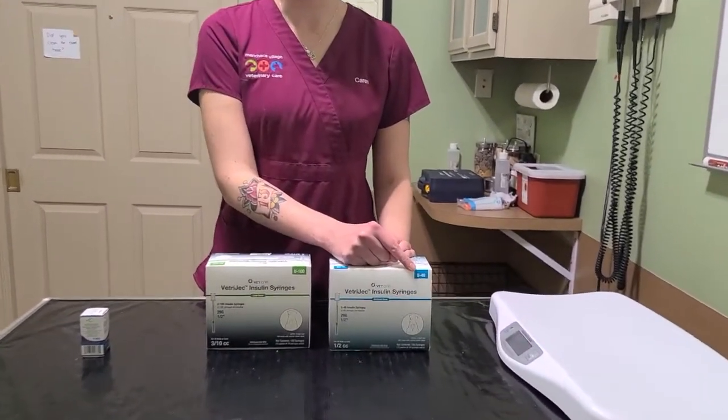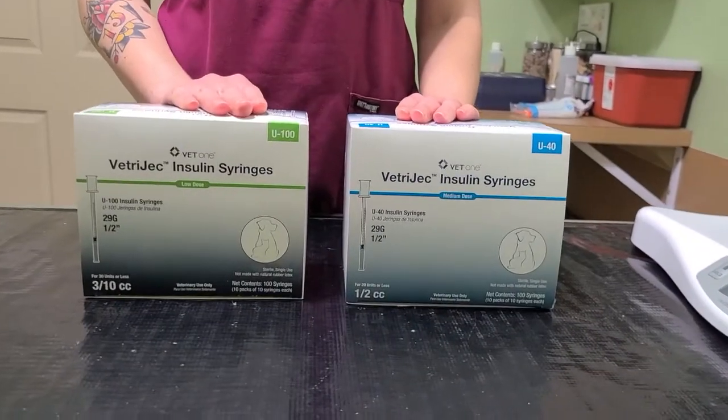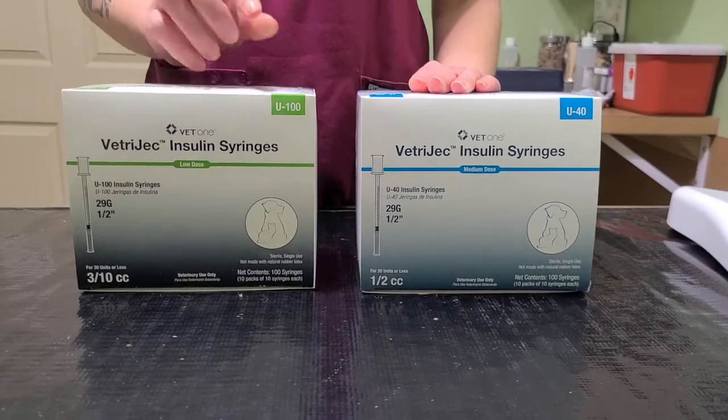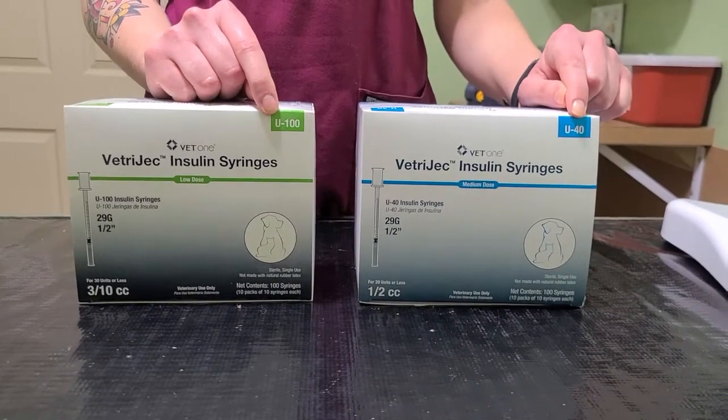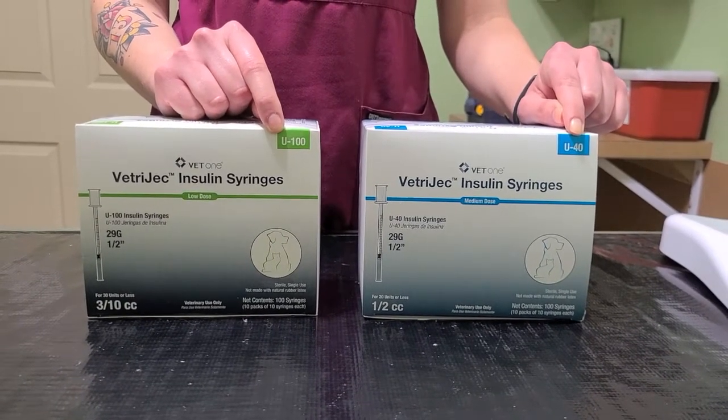For your insulin syringes, there are two types that you can purchase: U100s and U40s. These are very important to pay attention to because each type of insulin needs a different type of unit syringes. The U100s and the U40s have different types of measurement units, so pay very close attention to what type of insulin requires which unit.